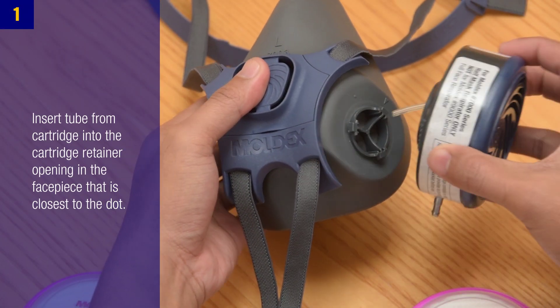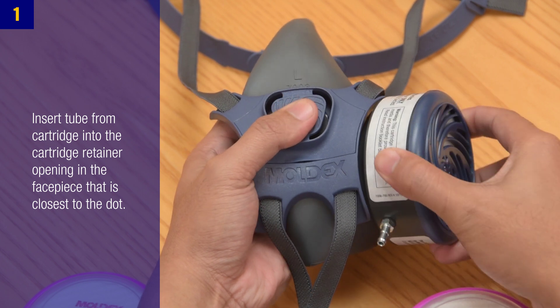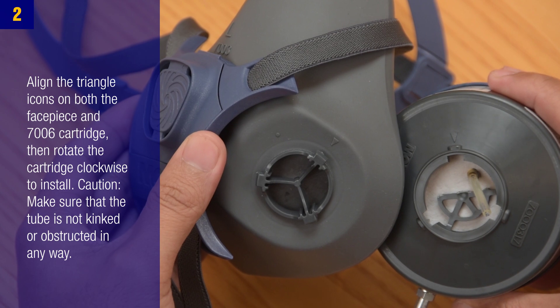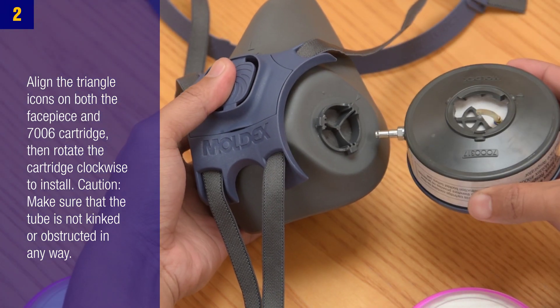Step 1: Insert the tube from the cartridge into the cartridge retainer opening in the face piece that is closest to the dot. Step 2: Align the triangle icons on both the face piece and the 7006 cartridge, then rotate the cartridge clockwise to install.